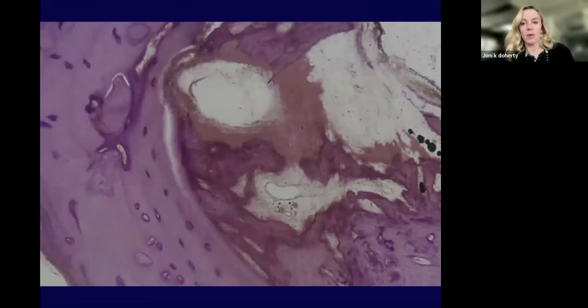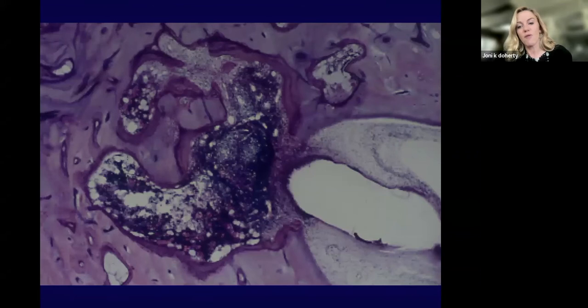So this is an example of insertional trauma where the endosteum is violated when the electrode array was inserted, and you can see the abundant fibrosis and some new bone formation within the scala tympani. So you can see that the amount of insertional trauma correlates with the amount of new fibrosis and new bone formation, and especially when the endosteum is violated, it results in a lot more damage. And this is another example of violating the endosteum. All this new bone formation occurs within the cochlear wall.